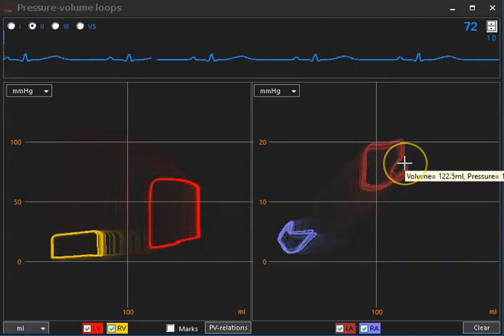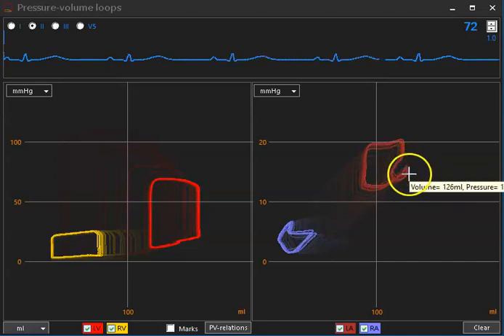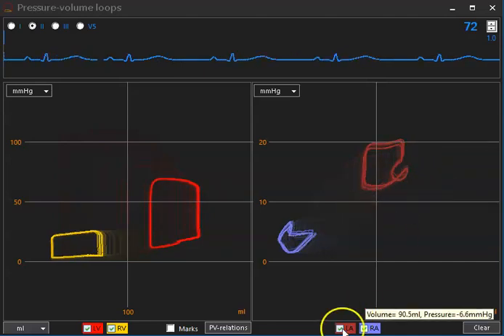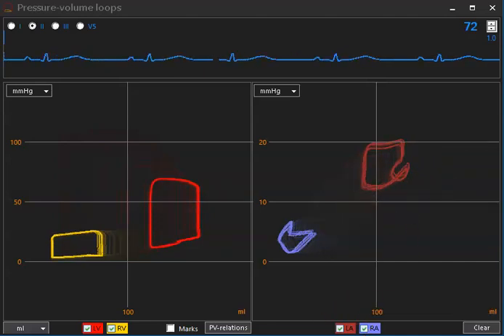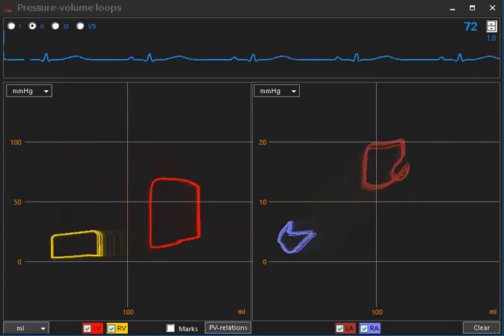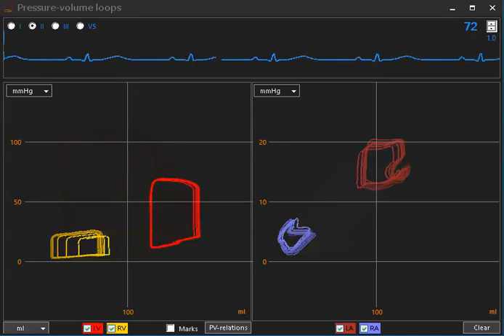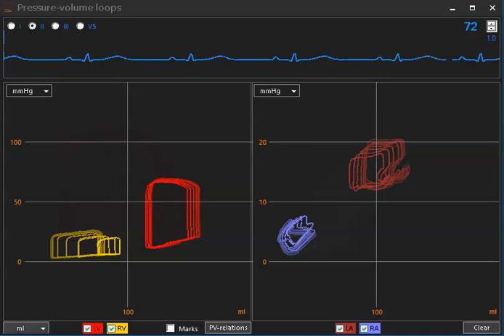To create biventricular failure, I also decrease contractility of the right ventricle. We can see that the yellow loops are moving to the right, meaning dilating left and right ventricle.